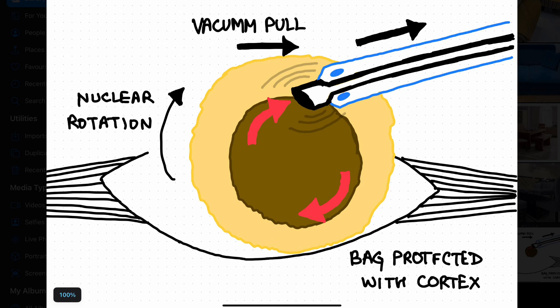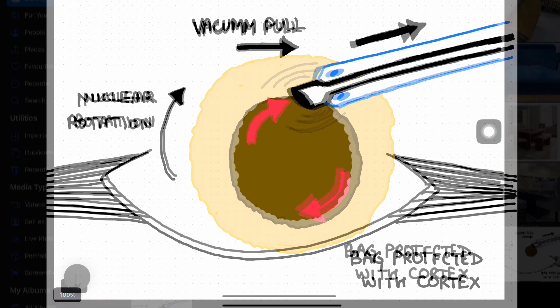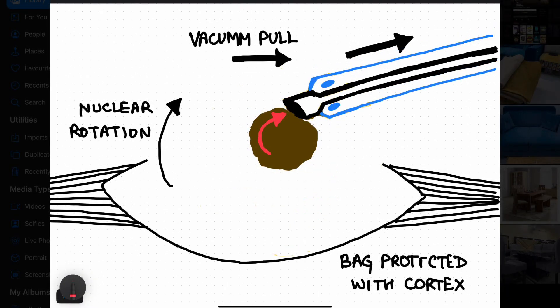Put your pedal down in phaco position 3 and grab a sweet spot between phaco position 2 and position 3. If your vectors are right, the nucleus will start rotating like a cartwheel, as depicted clearly in this photograph. You can see the ultrasonic energy from the tip at the junction of endo and cortex. As the nucleus starts rotating, you can see the vacuum pull and nuclear rotation — the bag is being protected with cortex. After a few seconds, the cortex is gone and the rim of the endonucleus has gone.